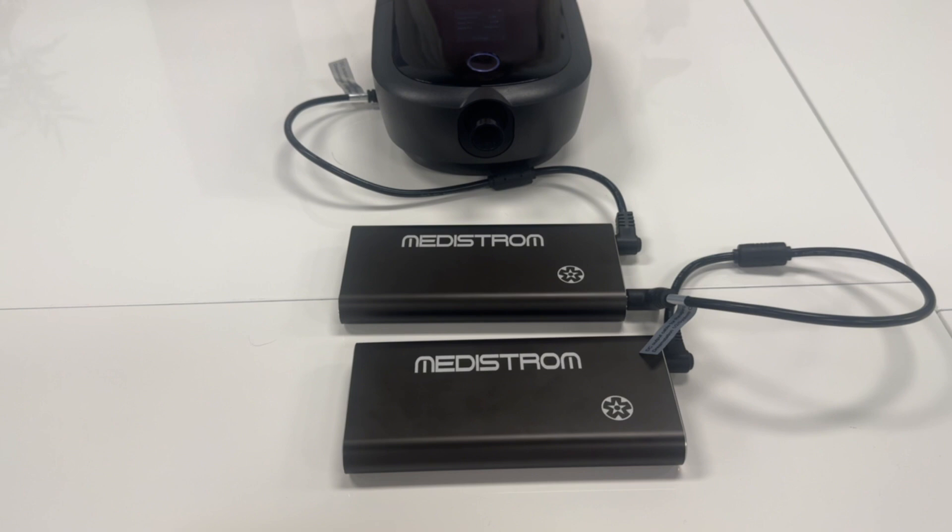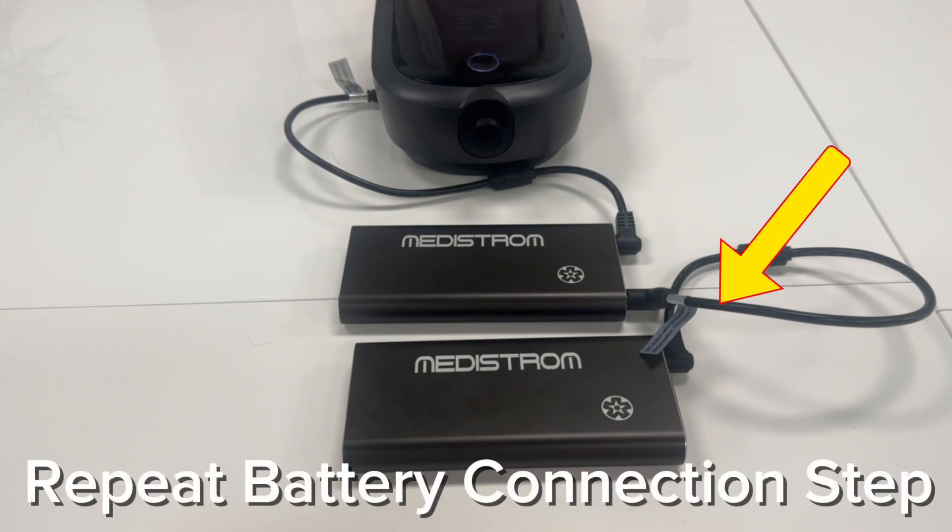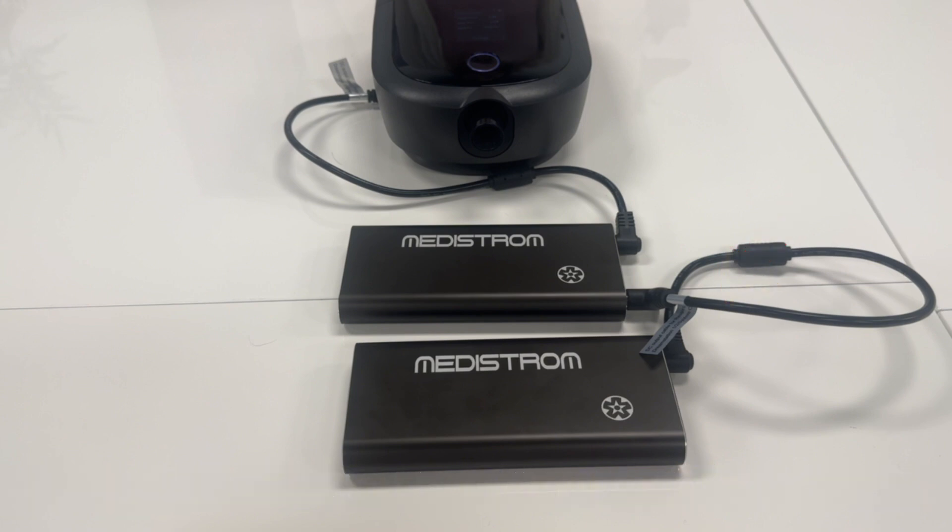If you wish to connect additional PilotFlex batteries, please repeat the step until all the batteries have been connected. Your PilotFlex batteries are now connected in series for an even longer battery life.